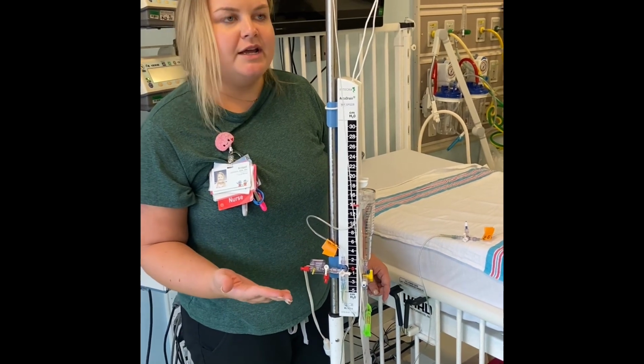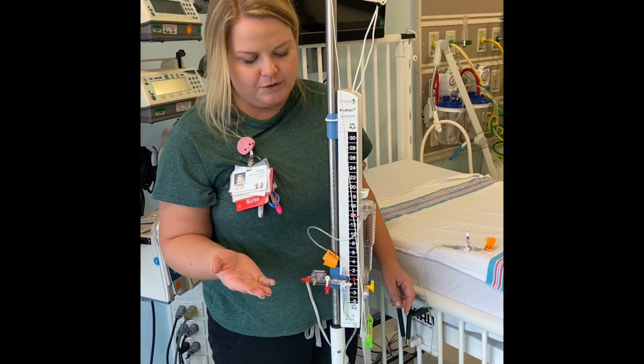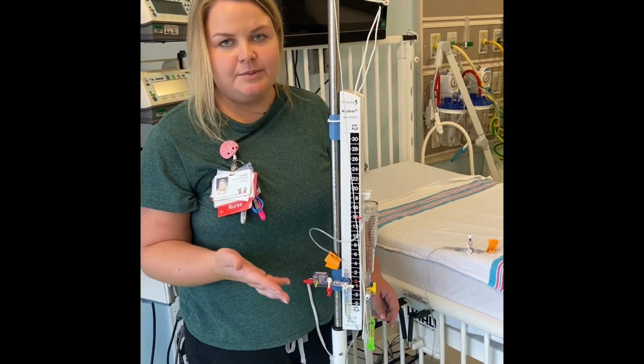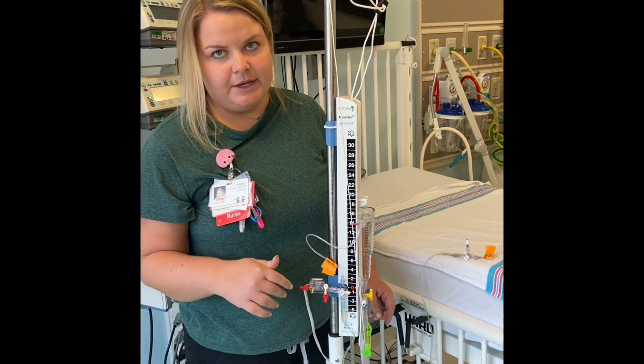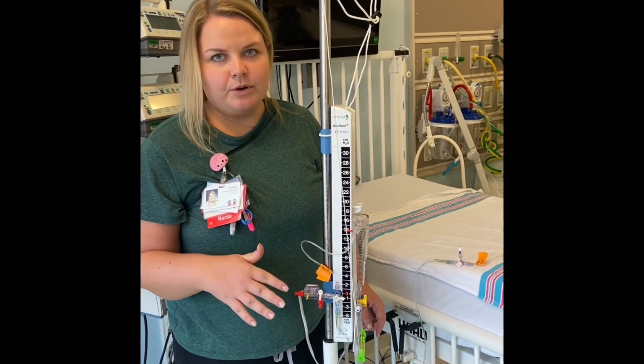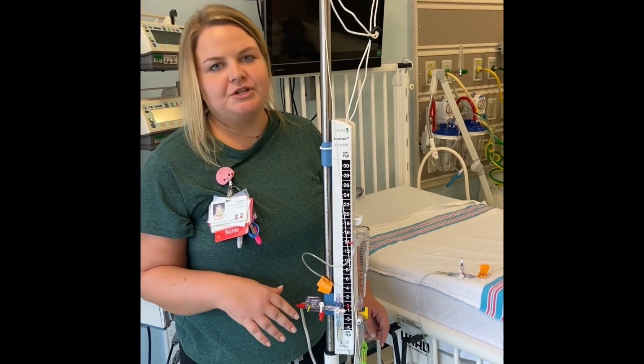So if you were trending at a 1 and now you're trending at a 5, that can give you a little bit of a hint that your ICP might be a little bit higher and that you should come in and transduce an ICP. However, it's super important to remember your trending ICP is not your true ICP and should never be charted.